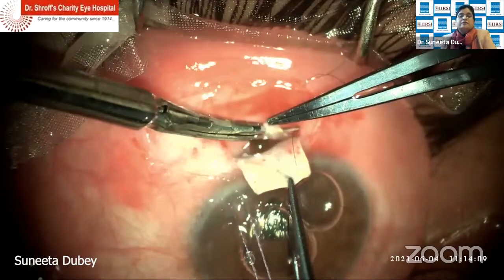And you could also use a Kelly's Descemet punch for this. Yes. There was another video wherein you can use both the techniques. Yes, I'll just come up to that. 2.2 keratome. For the learners, the paracentesis importance before entering. Yes, it's important. Okay. We'll show that one also.